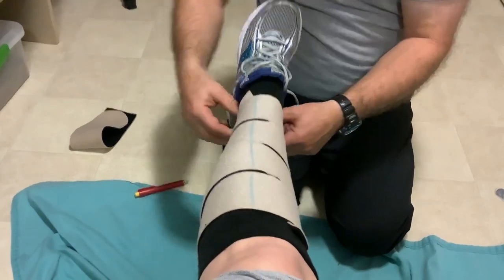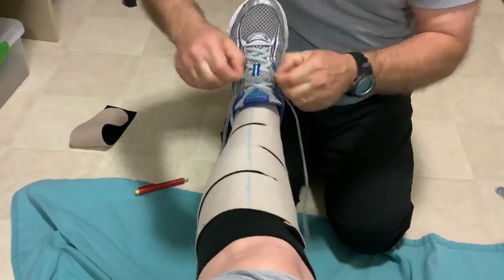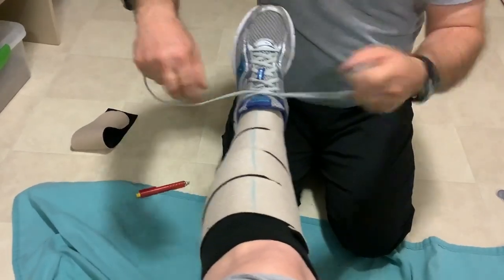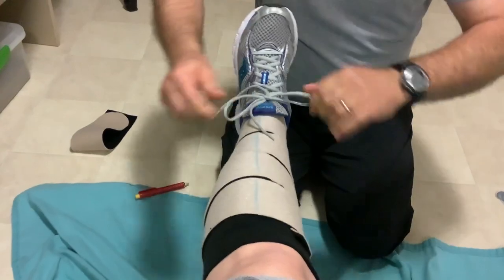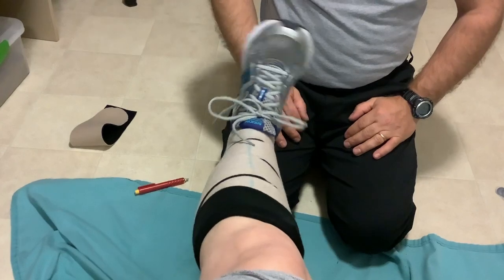Pull the shoe right back over the top. Make sure they know to snug that up as well — they don't have to be really tight, but you don't want any loose laces. Snug them up, then pull the top of the sock over so the Velcro isn't riding on the skin. And you're good to go.